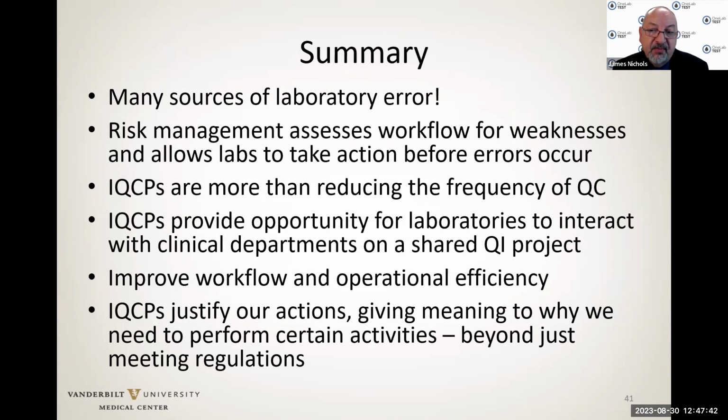IQCPs provide us with the opportunity to interact with clinical departments on a shared quality improvement project, and they improve our workflow and operational efficiency. Most importantly, IQCPs justify why we're doing what we're doing, not just because we're meeting regulations, but we are doing QC at this frequency because it's mitigating X, Y, and Z errors. So it's beyond just meeting regulations.